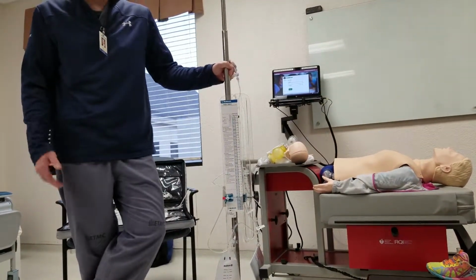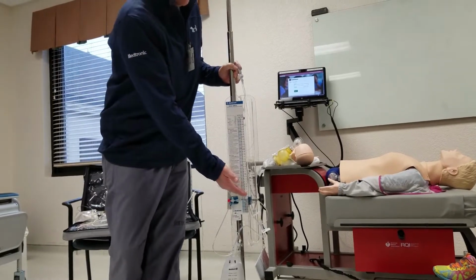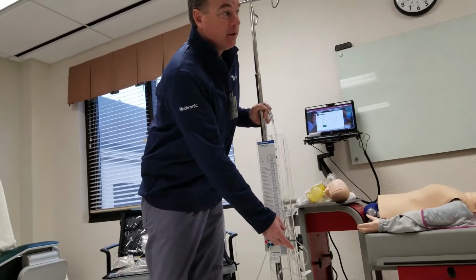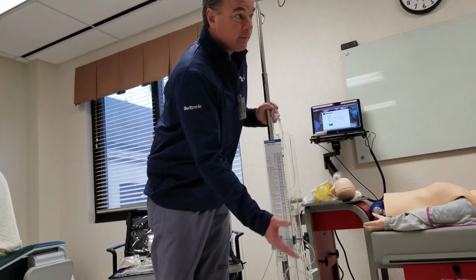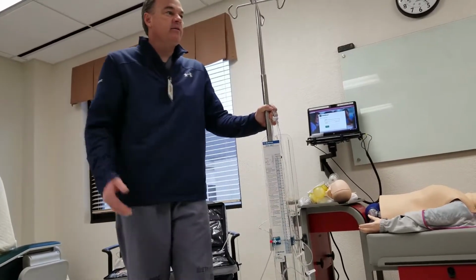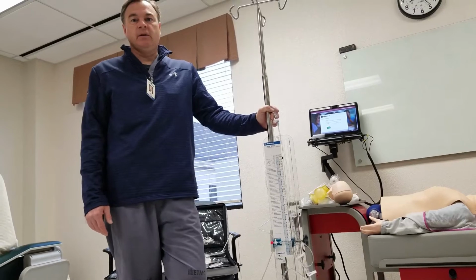It can get wet. Sometimes you'll hear that. If the patient were to get transported to CT and there's CSF in here, you actually want to lay it down. This filter here is Gore-Tex, so it can get wet. Occasionally we'll get that question.